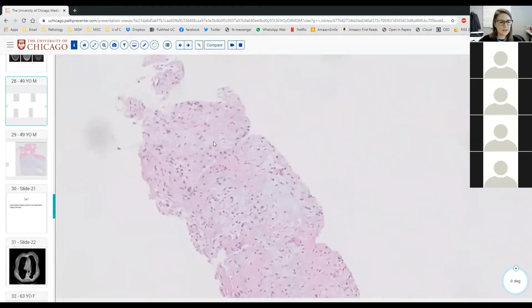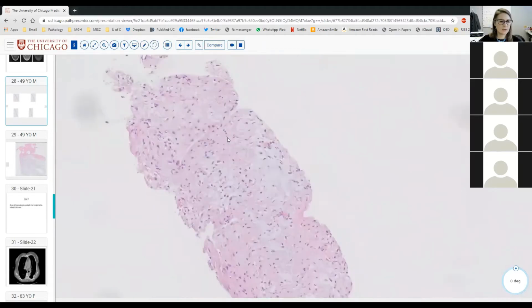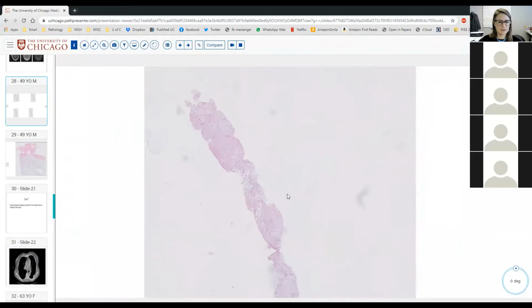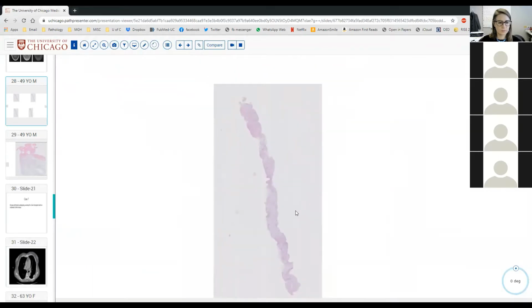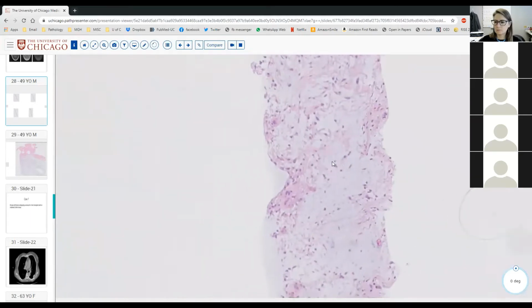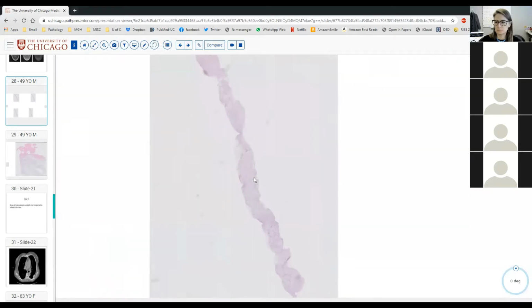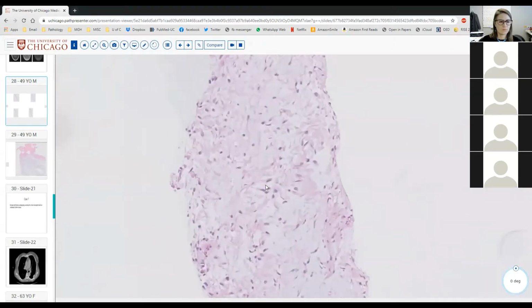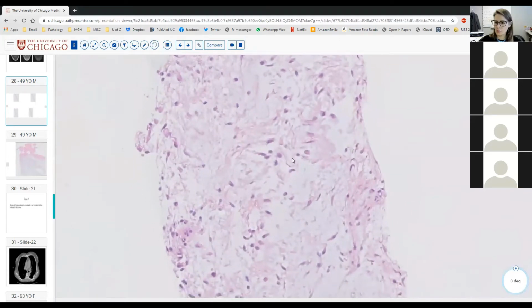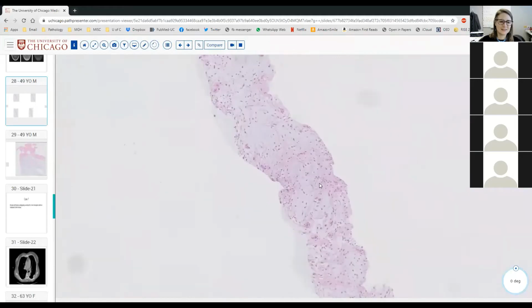active. So what would your differential diagnosis be, anybody can answer or type, based on these histologic features of the core? I was wondering maybe something like a neurofibroma, although I don't think it fits particularly well. Okay. Yeah, I was convincing myself that I saw shredded carrots, quote unquote, but looking again at this, I'm not quite sure that would have been the best.